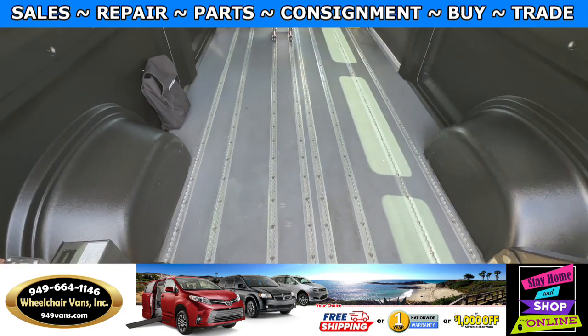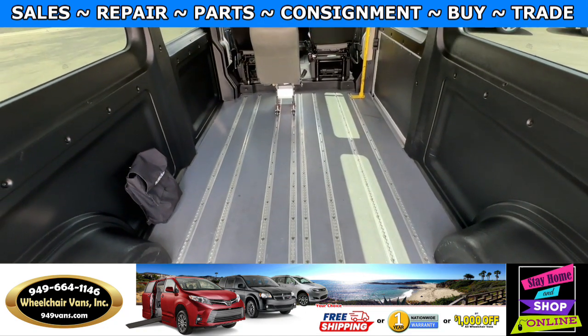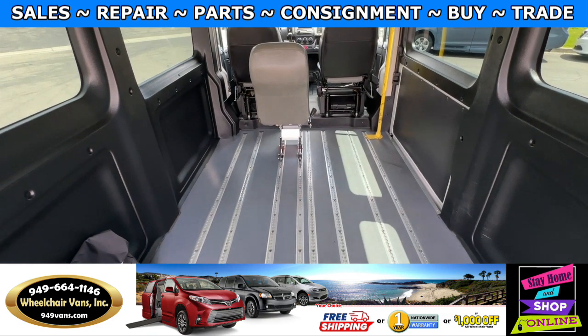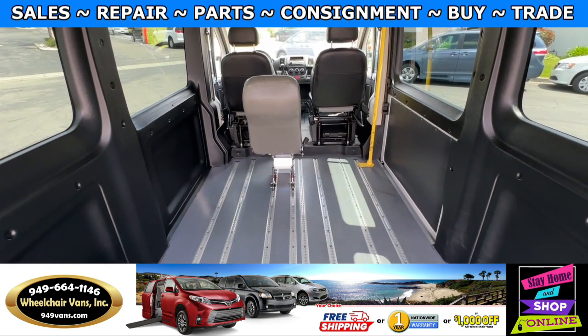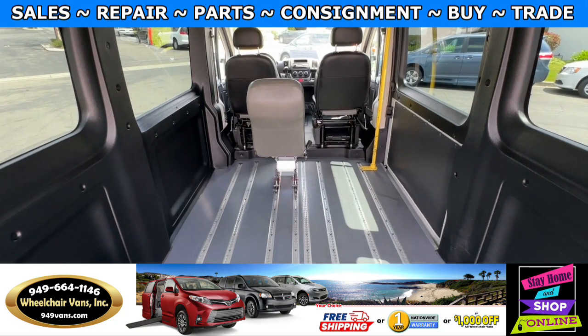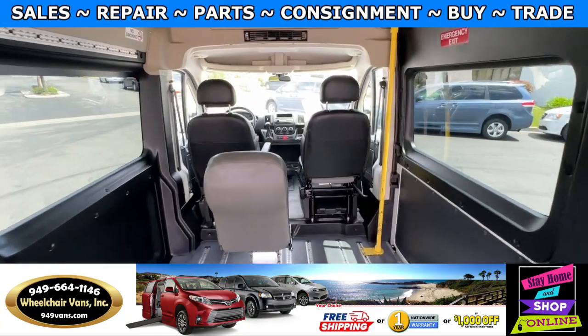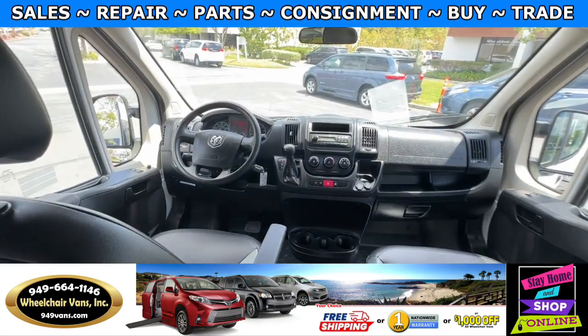As we make our way inside the van, you will notice this is going to have the smart tracks on the floor. With these tracks you can actually add chairs in any position you'd like, and you can take away chairs as well. You can fit up to two wheelchairs, if not three. This van is going to have 73,000 miles.